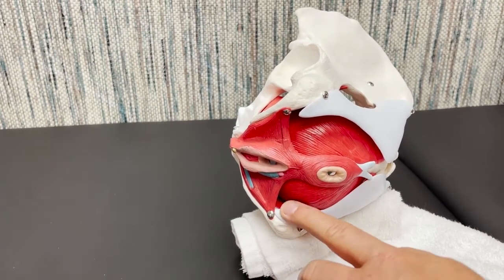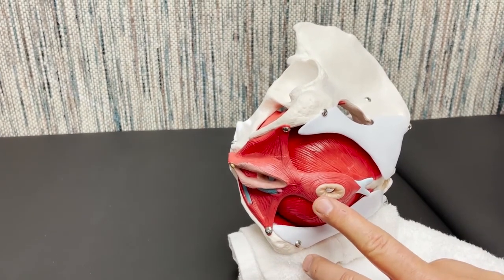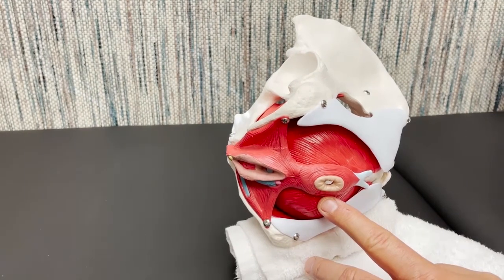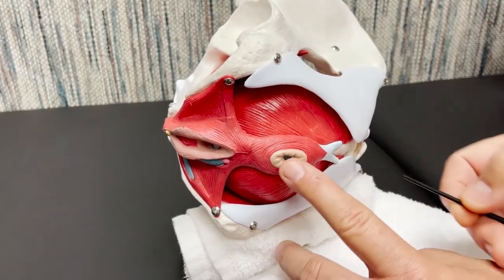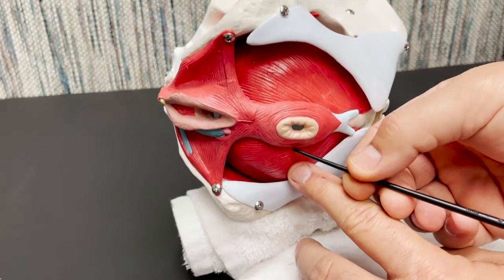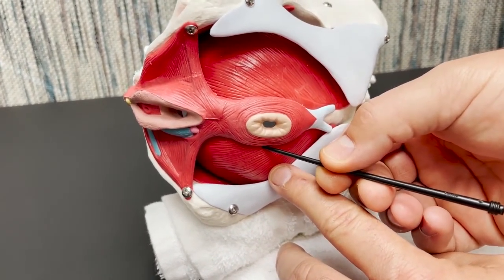We're going to confirm our muscle depth here with a pelvic floor muscle contraction, and then immediately adjacent to the anal sphincter, we're going to needle 45 degrees anteriorly, parallel to the treatment table. Again, a 3 centimeter needle, 1 finger breadth lateral, so just adjacent, 45 degrees anteriorly, and we're going to be parallel to the treatment table.